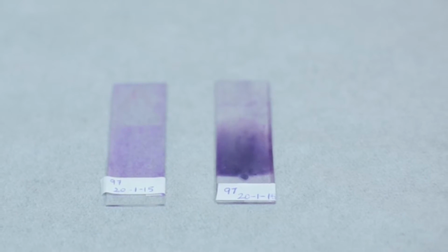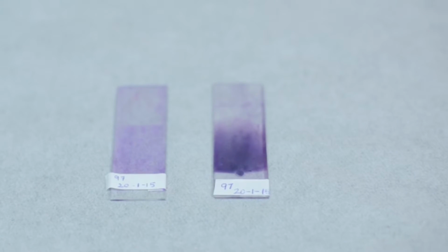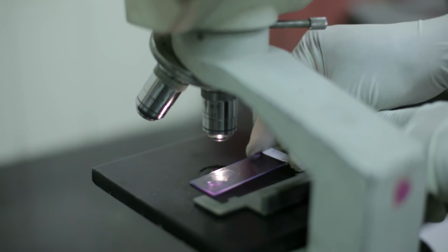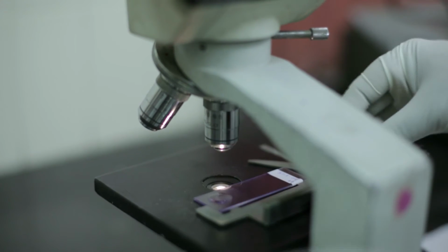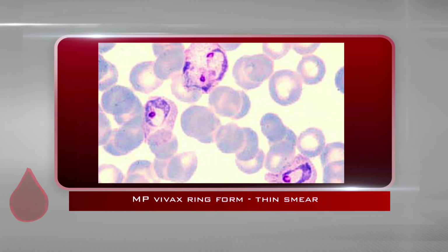Ideally, thick smears are examined for a minimum of 200 oil immersion fields by using 100x objective. If there is evidence of malarial parasite in the thick smear, identify the species by examining the thin smear. Now, let us see some pictures of malarial parasites in the peripheral blood smear.